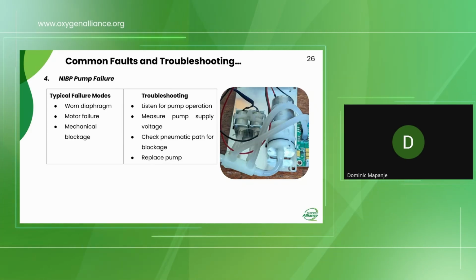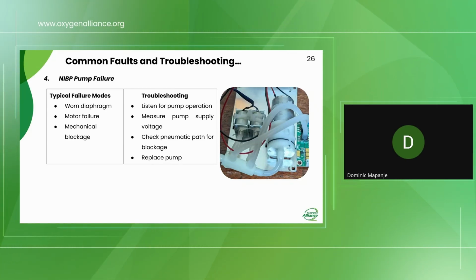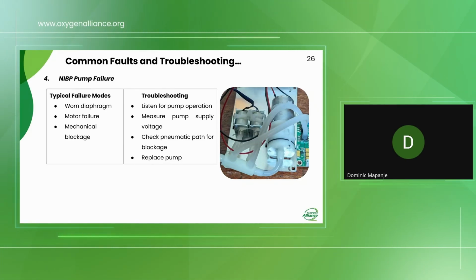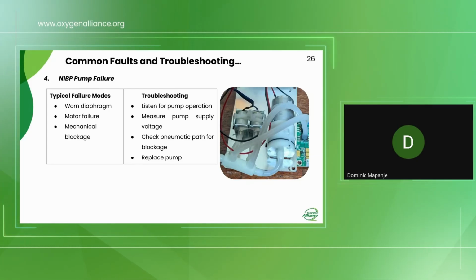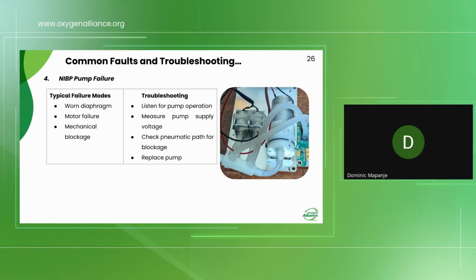Is it the pump itself? So how to troubleshoot for this? You actually listen to the pump operation. So if it is, you can actually hear it in most monitors. You can actually hear it in operation.